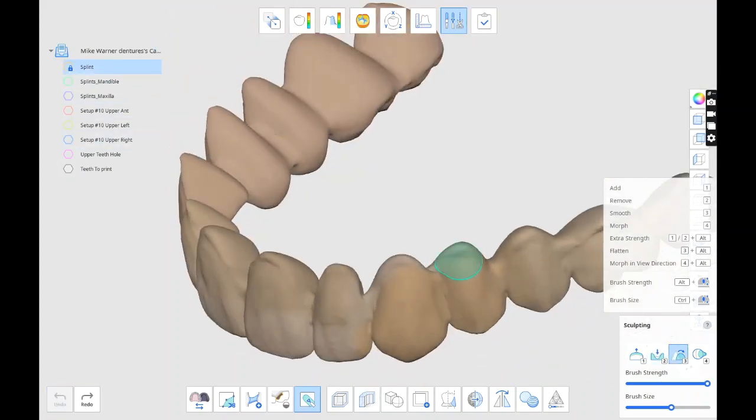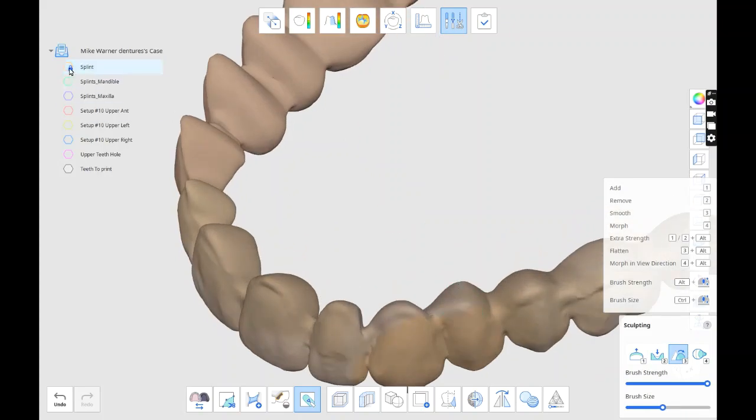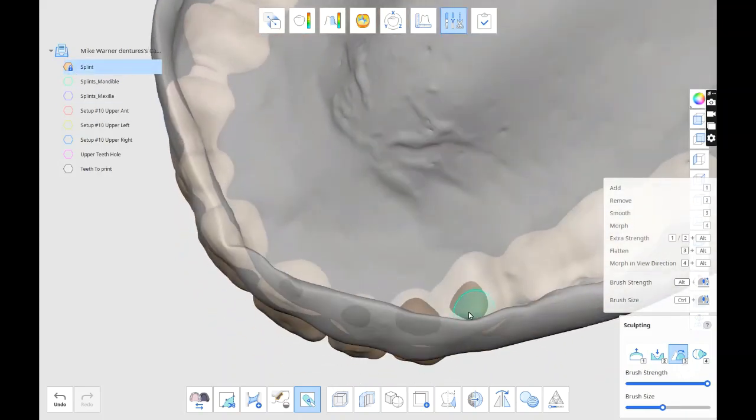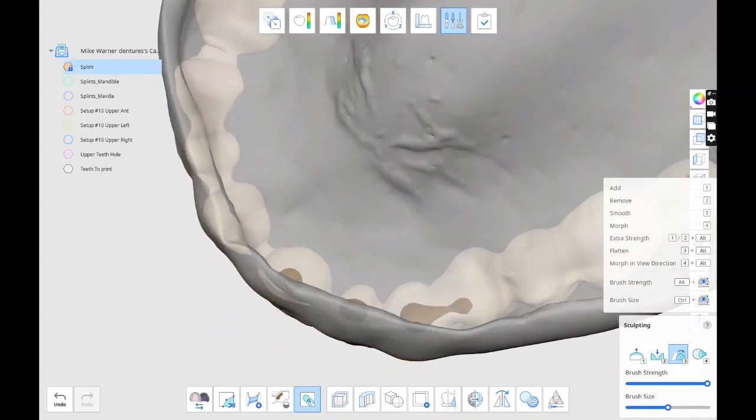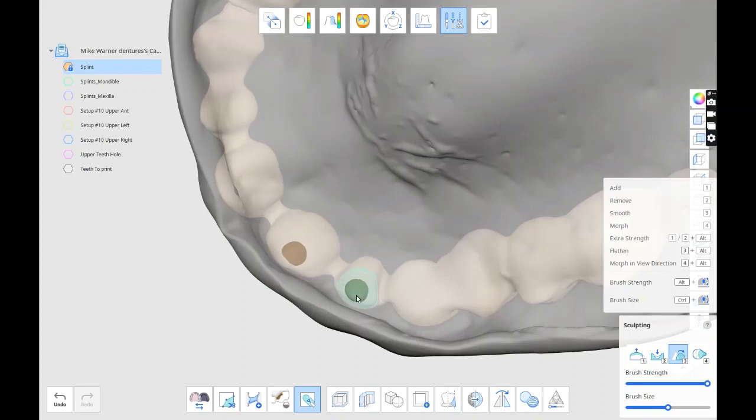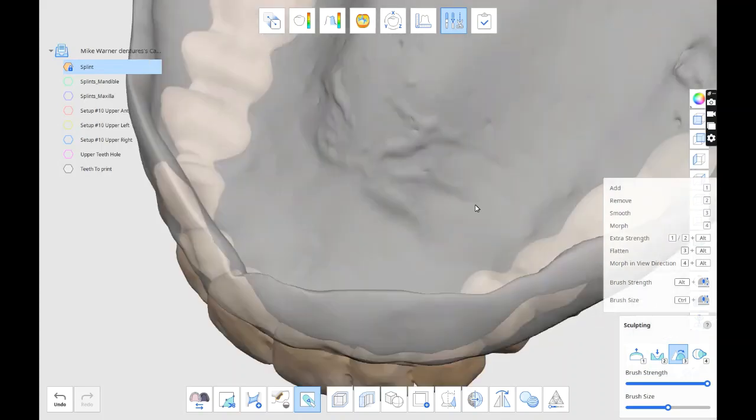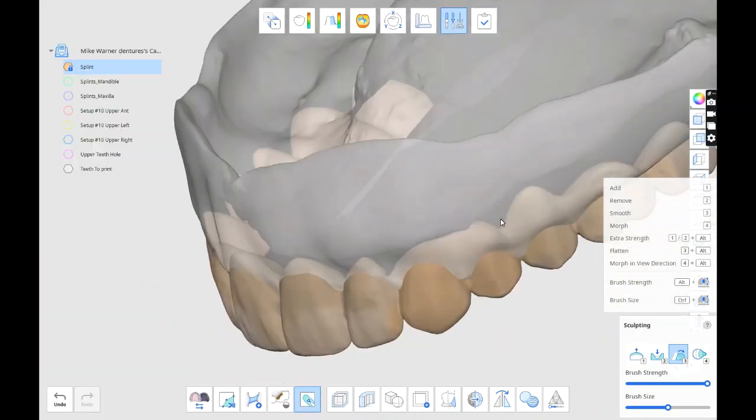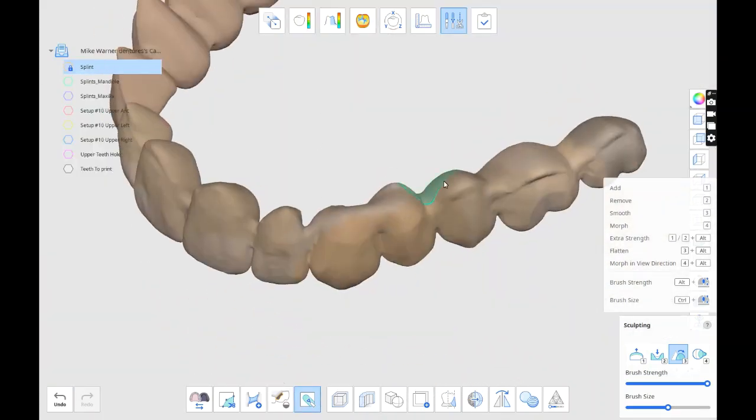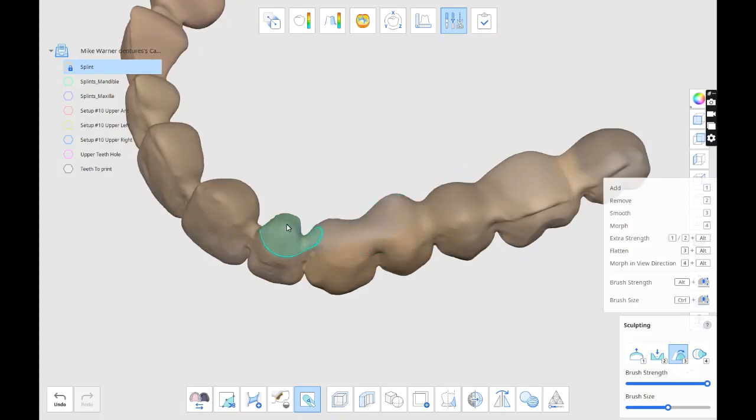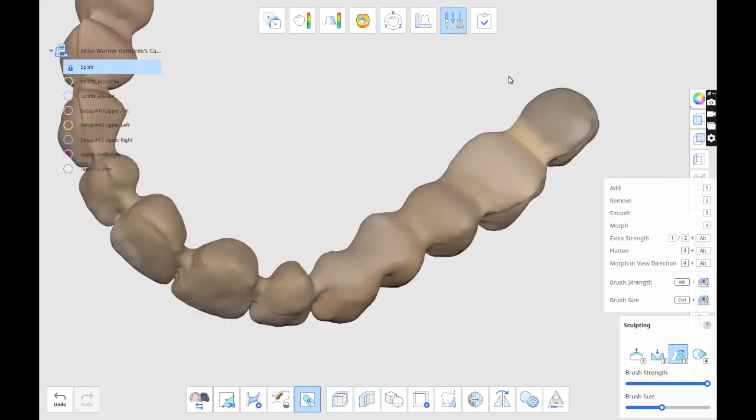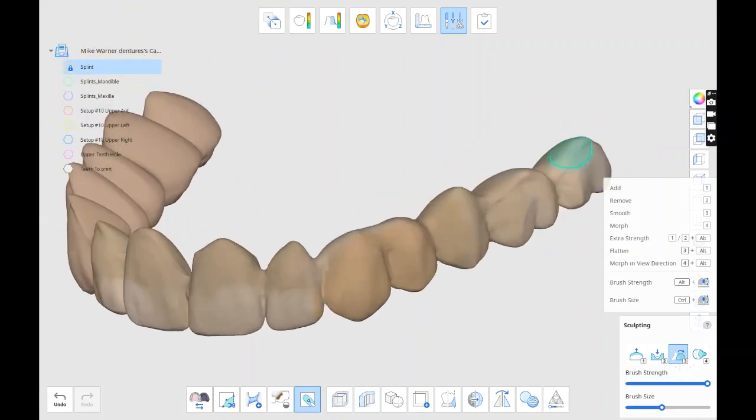Exocad, it's easier because you can lower the translucency of the model of the gums or whatever. And you can continue to adjust what's showing. But here you have to make sure you lock - like, lock what you don't want to get adjusted.